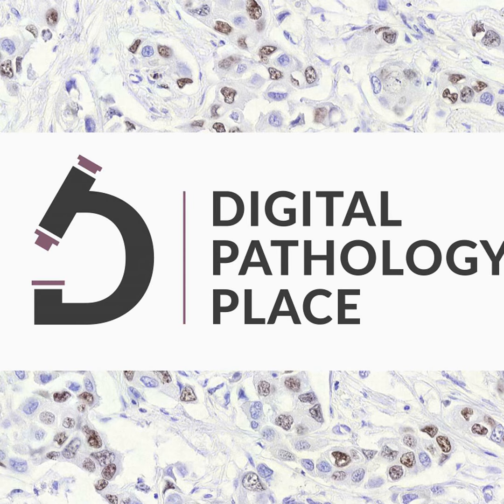Yes, I think the mission with us when we started swarm learning or using it for histopathology is to have each center, each histology center all over the world to just scan their slides and contribute to a model which is trained globally. All the centers across the world can train one single model for a particular mutation prediction, or maybe a generalized model for multi-mutation prediction. So that's the final aim that we are working towards. But at the moment, we are taking smaller steps because this is the whole overview.